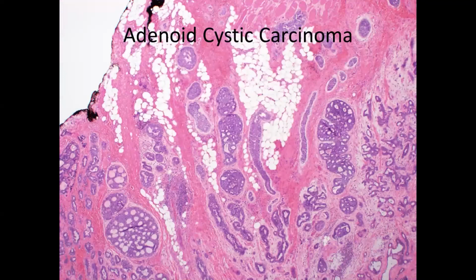In other areas, you can maybe expect to see areas that are more typical, with a more infiltrative growth pattern and a more cribriform and tubular sort of architecture. But again, not all adenoid cystics are going to have this classic growth pattern that's going to give you stromal balls in an aspirate. Sometimes you'll just get solid adenoid cystics, and in those cases, there's not really much stromal material to be had in the case of an aspirate.